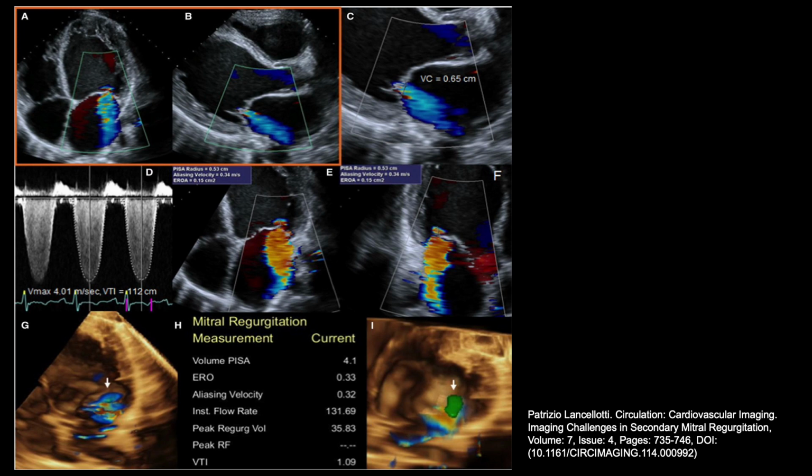Transthoracic echocardiography is an excellent method for assessing the mechanism and severity of ischemic mitral regurgitation, although with some limitations. A combination of two-dimensional echocardiography, spectral and color Doppler parameters from the standard approach is used to quantify the degree of secondary mitral regurgitation. Large central mitral regurgitation jets reaching the left atrial roof and pulmonary veins suggest significant mitral regurgitation.